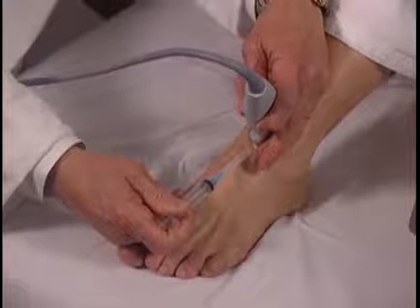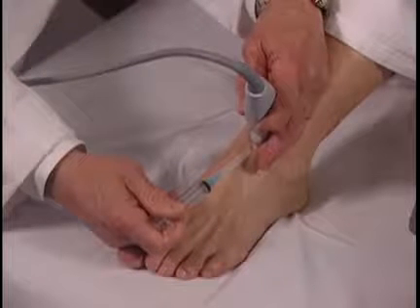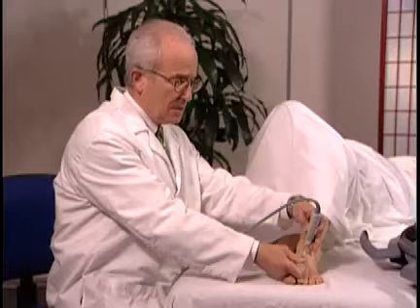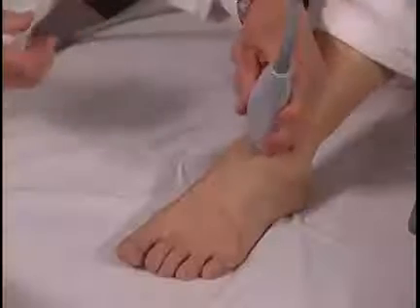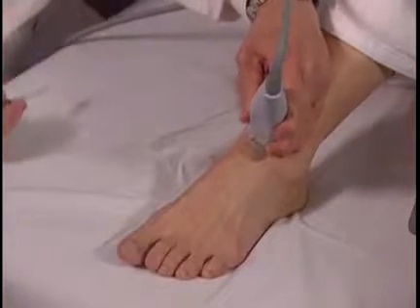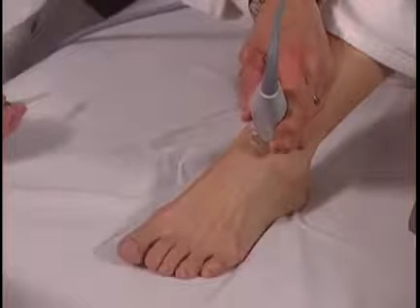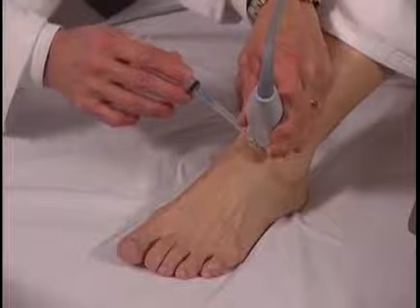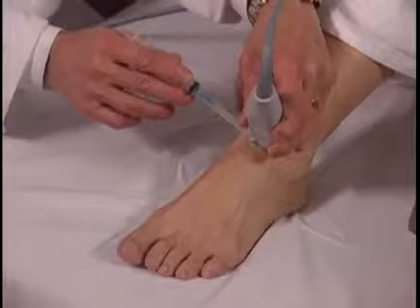Sometimes this is very easy to do, especially when a person has full mobility of the ankle and the ankle can be kept in this orientation. Sometimes it's necessary to visualize the effusion by holding the transducer transversely and then injecting or aspirating with the needle parallel to the transducer with the approach this way.